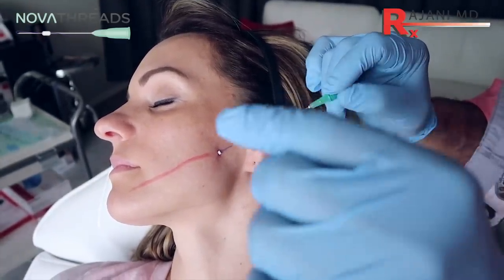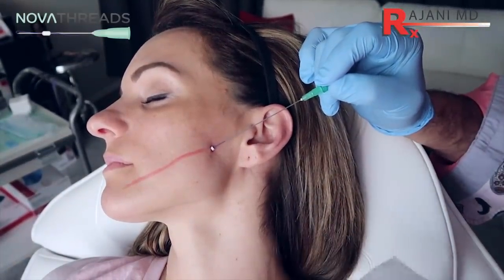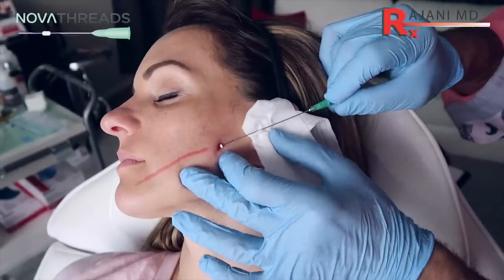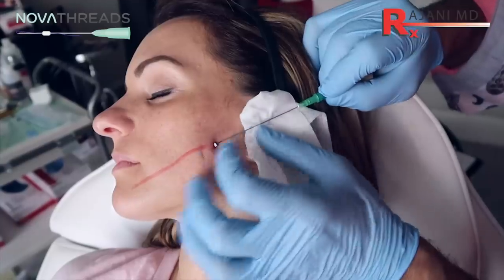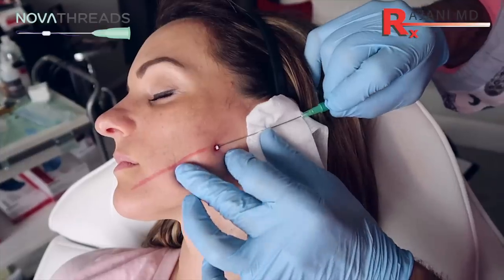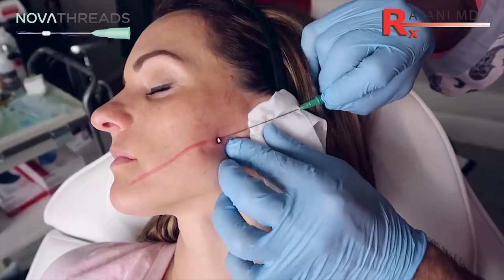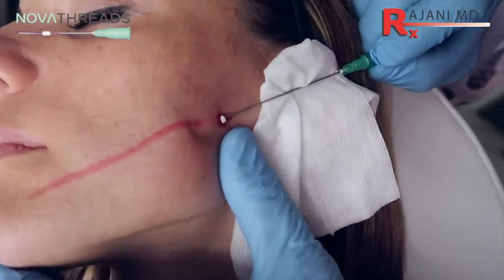We're going to place this in a fashion that protects where the thread is. In this area we have a nice straight shot. Initially we've got to get through a layer of tissue, so you might feel a little click here. The depth and going in one direction is important — again, a straight shot. You can just see it traversing. I'm stabilizing with my hand. A little pop through this tissue. You can go a little bit back, but you can't bring the thread all the way back or it will be engaged.